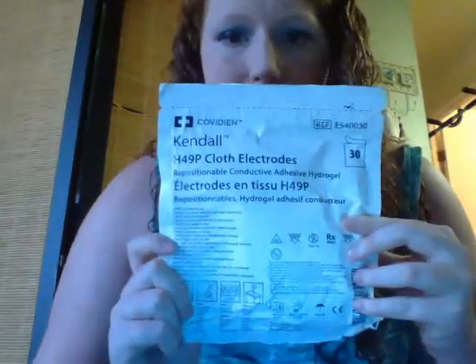They sent me these other ones, called Kendall cloth electrodes, and these things are horrible. They look like this, and there's a lot more in the package, and they just don't stick whatsoever. I even told my husband maybe I'll just use these when I'm sleeping, because they're much more comfortable than the other ones, which irritate your skin, itch, and bother it. And they just fall off instantly.